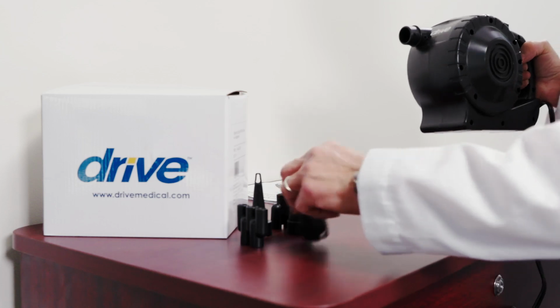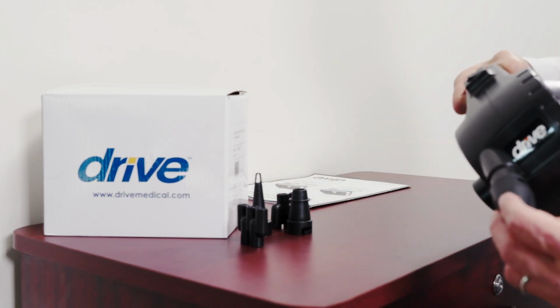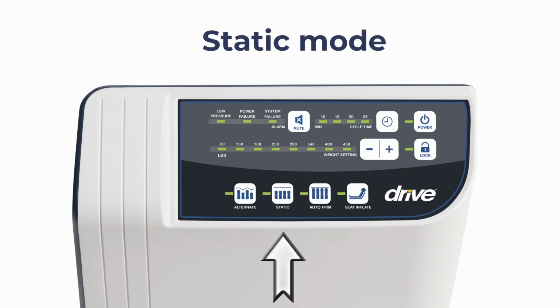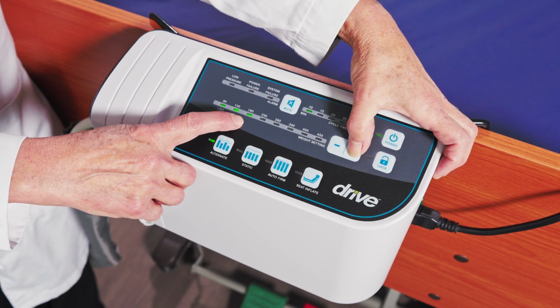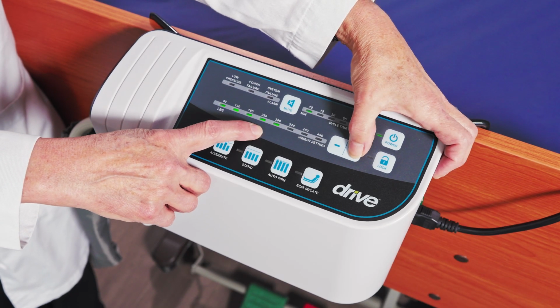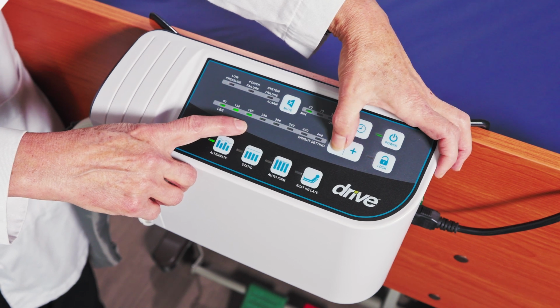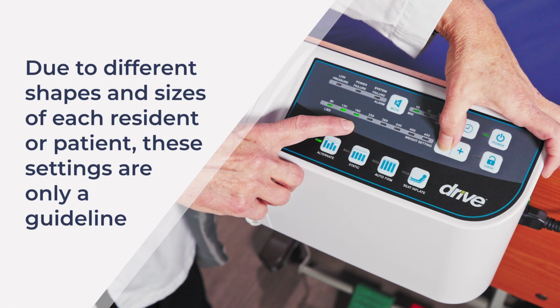Quick fill adapters are included with every MedAire Plus. When the initial inflation or auto firm process is completed, the PreserveTech MedAire Edge will automatically enter static mode. Using the patient's weight setting buttons, adjust according to the weight and height of the patient. Please note, due to different shapes and sizes of each resident or patient, these settings are only a guideline.